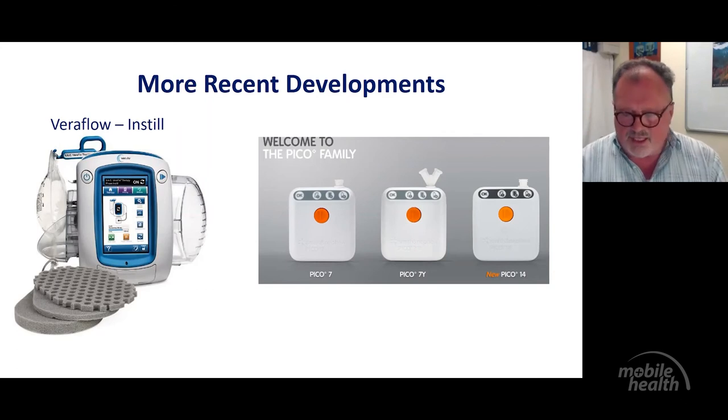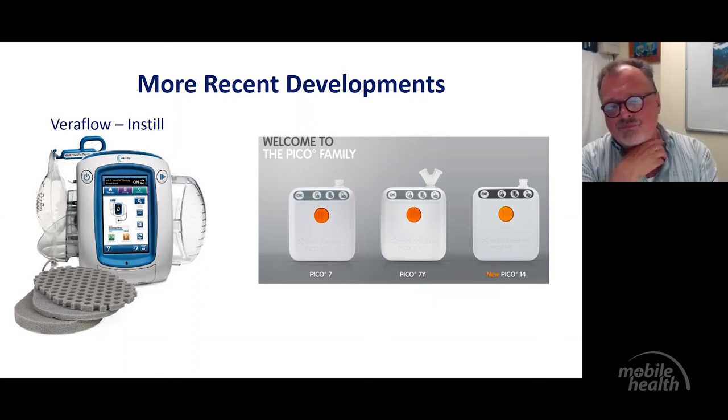The new one which we're trialing at the moment is PICO 14. This is a system where the pump is more advanced. The pump is stronger. We can use it for deeper sinuses, for deeper wounds, so they go down to 5-6 centimeters. It's just got a stronger motor in it, basically. It can be left in place for up to a fortnight. Dressing changes can be applied, all right? And we're doing a case series on groin dissection after vascular surgery. It's an interesting concept too.